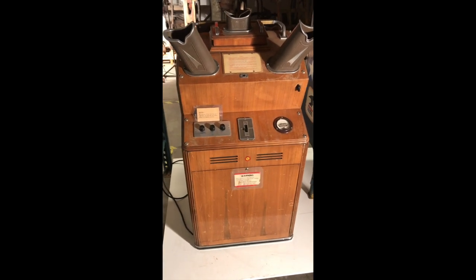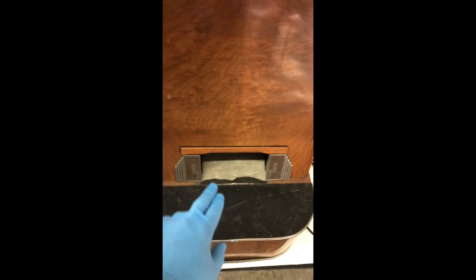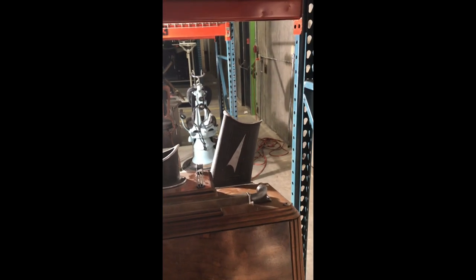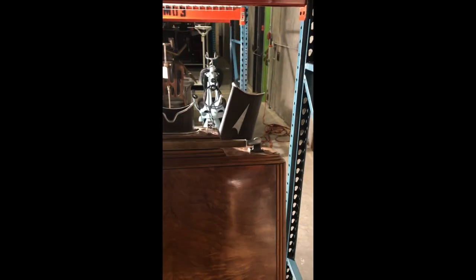This shoe fitting fluoroscope allowed customers to put on the shoe they were thinking about buying, come up to the machine, stand on this little black platform, grab onto this handle, and stick their foot into this hole. The device would be turned on and your foot would be bombarded by x-rays. By looking through the viewports, you could see how the shoe was fitted to your foot. Three different ports: one for the person whose foot is being x-rayed, one for the shoe salesman, and a third for an interested party — presumably a mother watching her child's fitting.